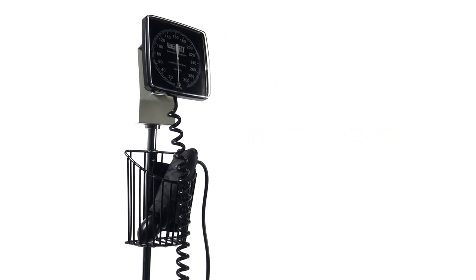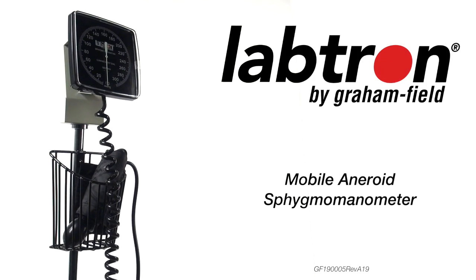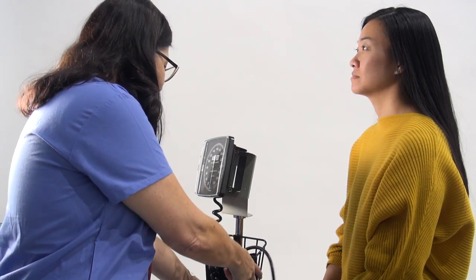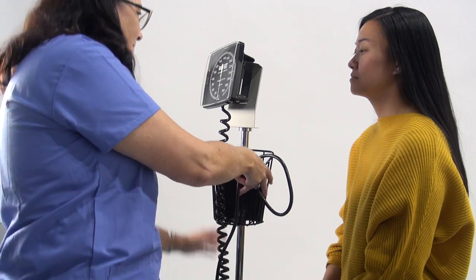The Labtron mobile aneroid sphygmomanometer is designed to facilitate easy and convenient blood pressure reading. The gauge on the mobile sphygmomanometer is mounted onto the height adjustable mobile base.